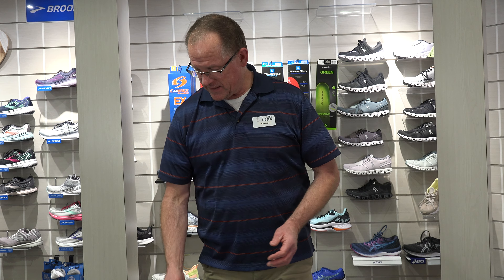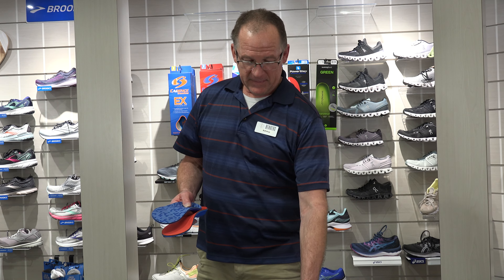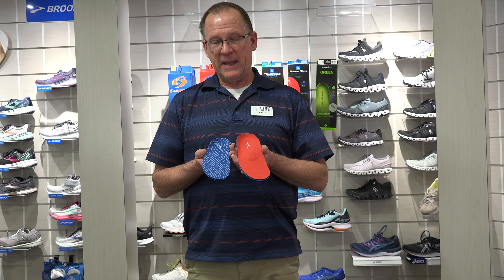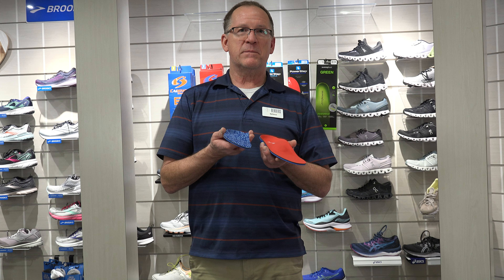We have a couple of designs here. There is the Cadence, and there is the Power Step. And then, of course, we have Super Feet. I lean pretty heavily toward Cadence, as most of you guys know, especially when it comes to the transverse arch.